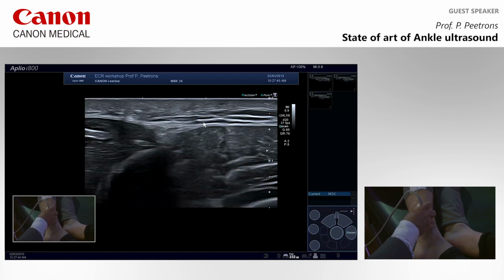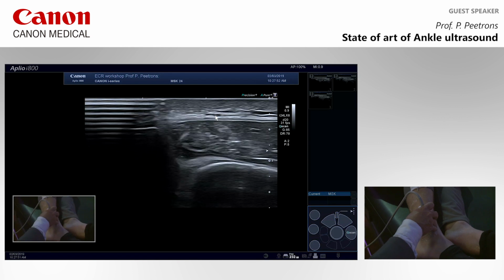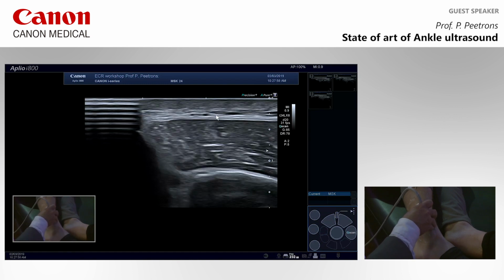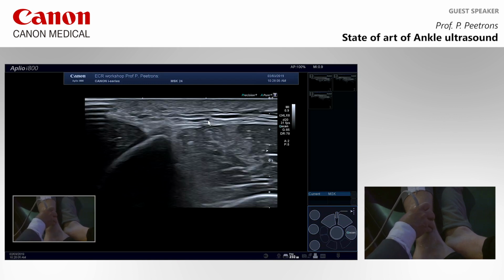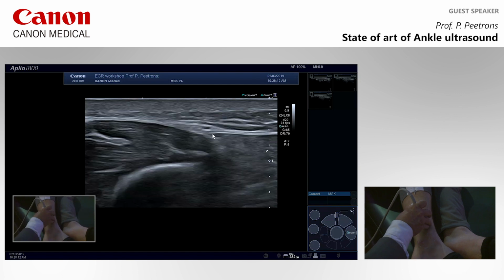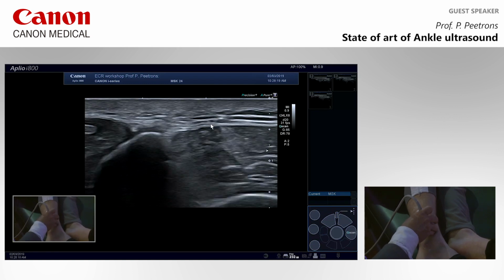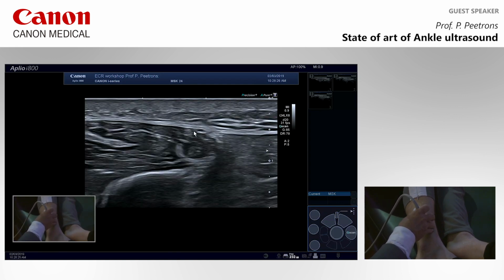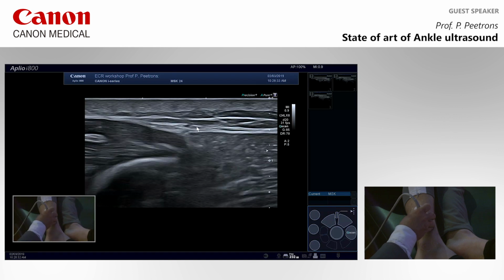And you see that at that exact level, 10 centimeters above the malleolus, this superficial peroneal nerve is becoming subcutaneous. So subcutaneous. And you can follow it everywhere. But exactly here, it is coming from the subcutaneous part of the leg to the infrafascial part of the leg, and then to the muscular part of the leg. Okay, and this is exactly where you will find the neuroma of this superficial peroneal nerve. Of course, this is a 24 megahertz probe. I think you can see it with every equipment, but not as well sometimes. But this is exactly where it is crossing the fascia.